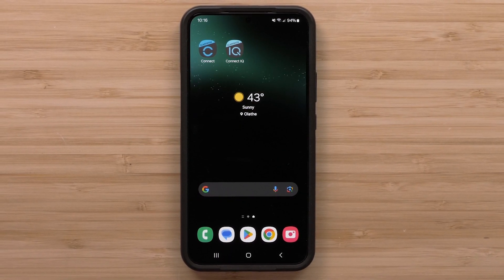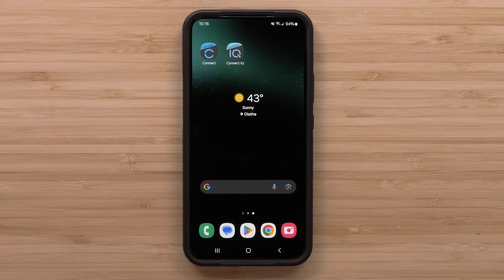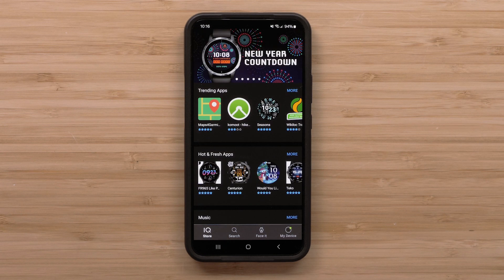To begin, you will need to create a custom watch face using FaceIt in the Connect IQ Store app. Start by opening the Connect IQ Store app on your compatible smartphone, then select FaceIt.